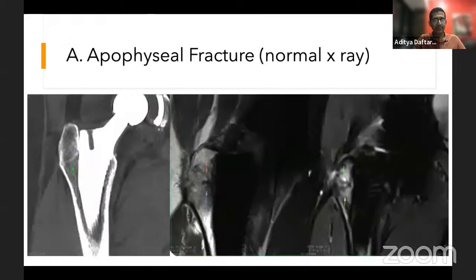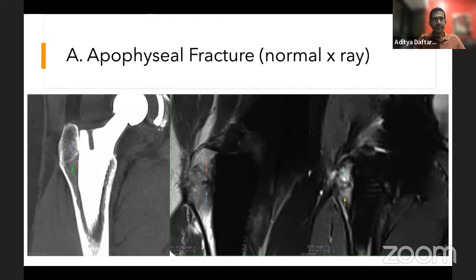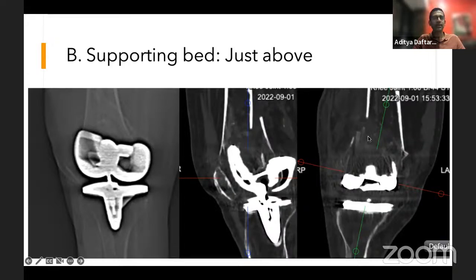Here's an example of a radiographically occult apophysial fracture — visible on CT as a linear line. On MRI, the line is visible again along with bone marrow edema, confirming a non-displaced greater trochanter fracture. Another example: a scout CT image shows possible bone liftoff, and the CT cuts clearly show a fracture just above the level of the femoral component, with details useful for management.